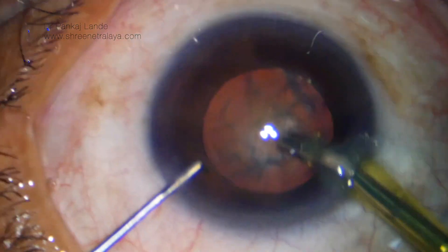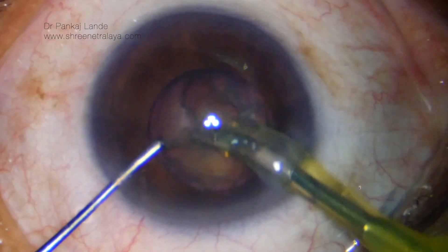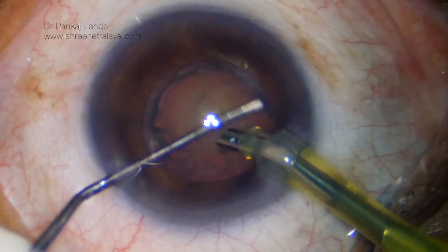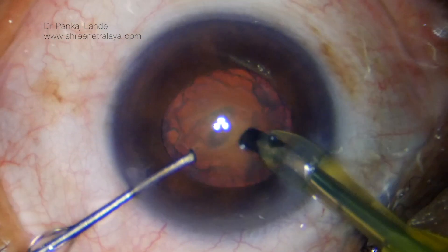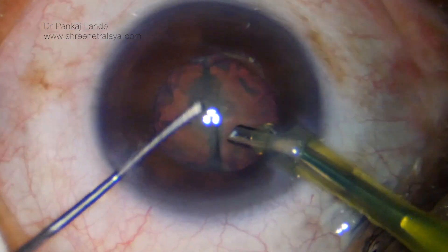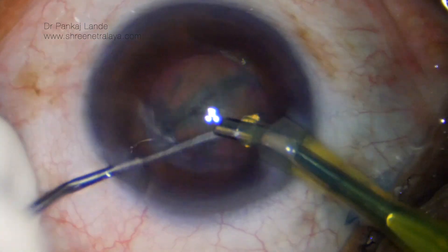Here I am using a side-cut chopper and you will see the advantage of the side-cut chopper in this case. Once the phaco probe is in, I am having my phaco pedal in position 2 and I am clearing the cortex. The first chop is done, and I am rotating it 180 degrees to make two halves.